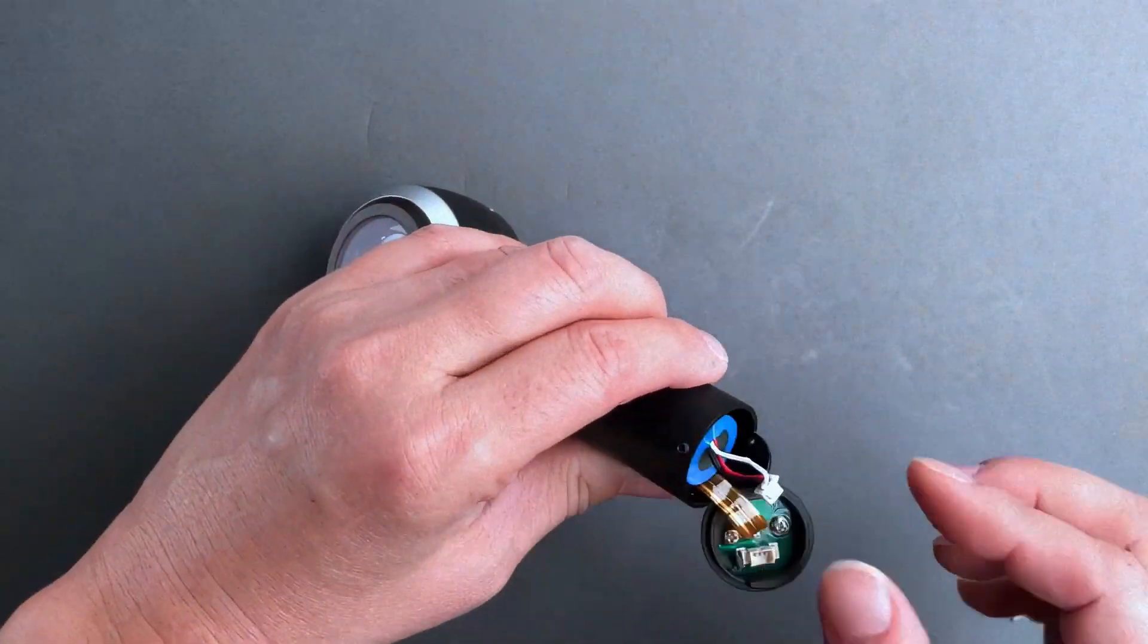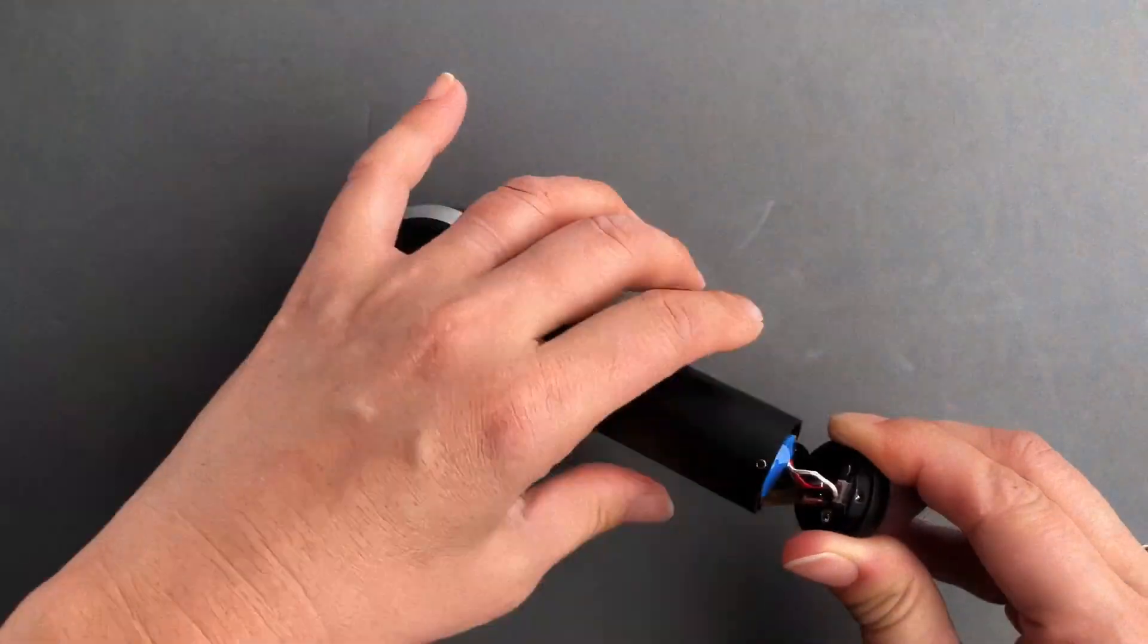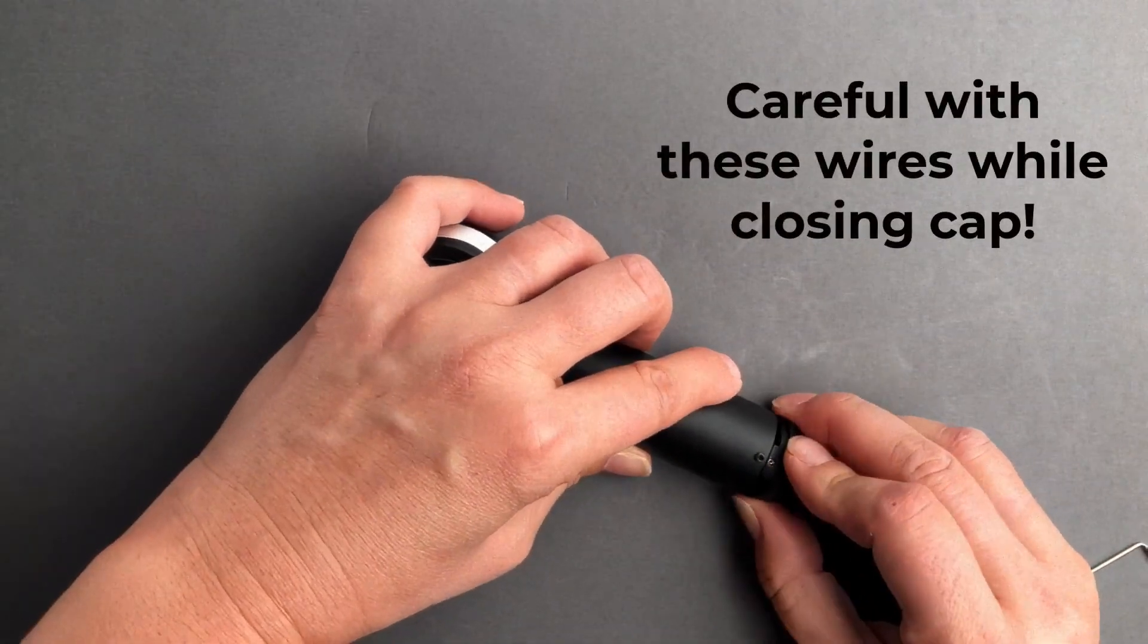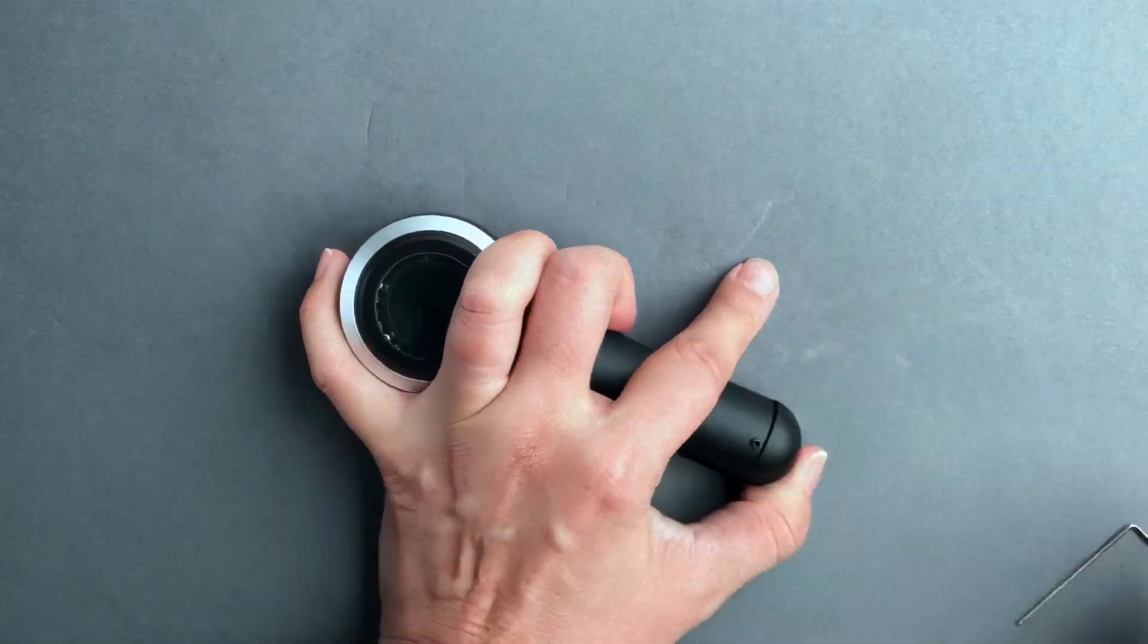Then insert the new battery and reconnect the battery connector. Finally, you'll close the battery cap, being careful not to damage any wires while pushing it into place, and then just tighten the set screw.